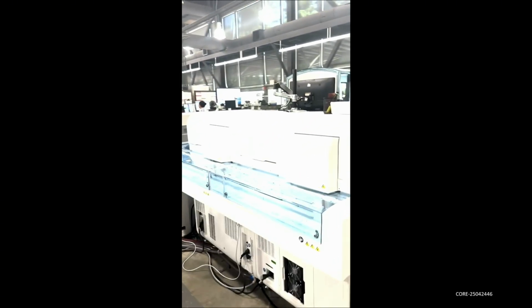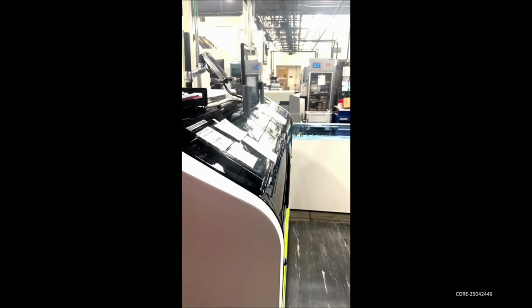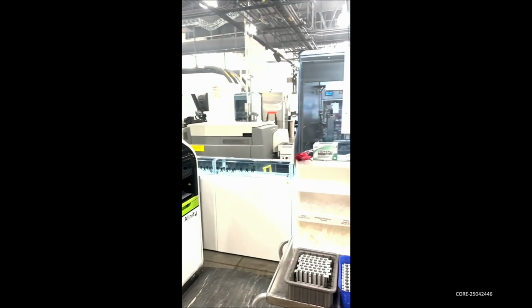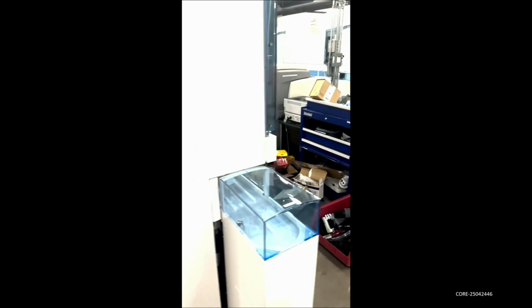And what we wanted to do is connect coag. So we have a third-party coag that's considered best in class, so we went with them. And then another third-party for hematology was also considered best in class. And we're adding another vision product to be able to have that added to it. Now we're cooking with gas. Total automation. Remember, call back to where I was telling you about our designated level 2 trauma.